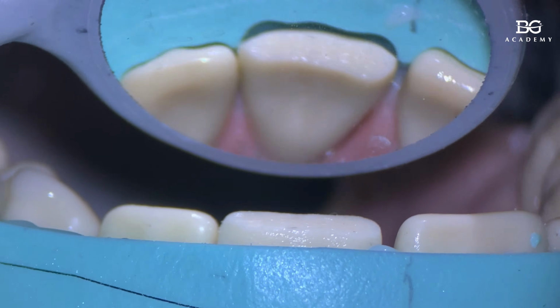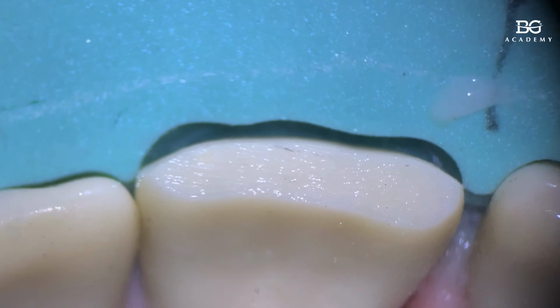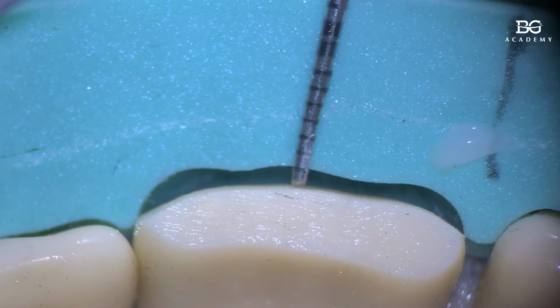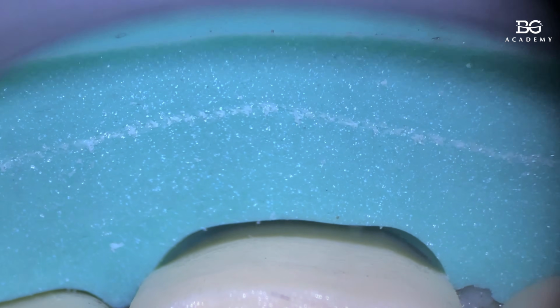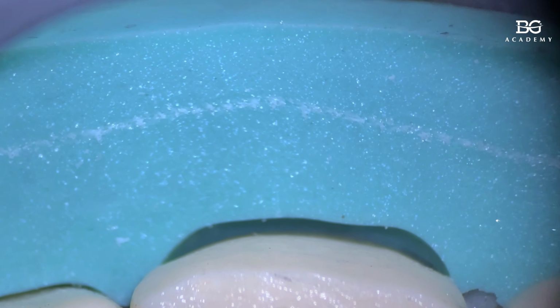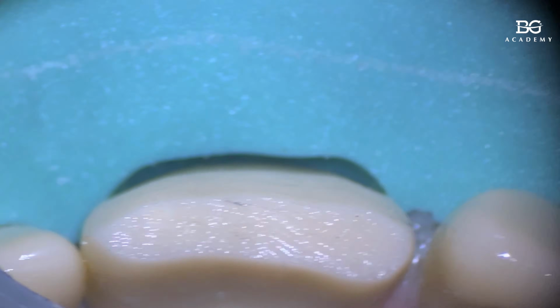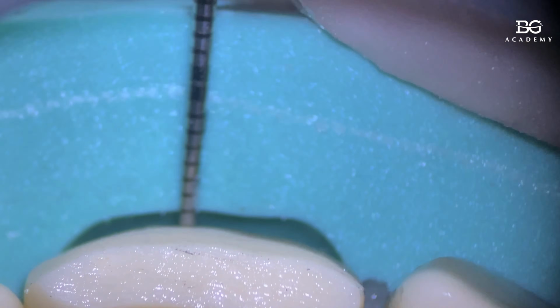So I will check with my mirror, with my periodontal probe. Here we have 0.5 millimeter. In the incisal plane, everything is fine, 0.5. But I use a 0.4 depth cutter, and I have my 0.5. This is what I was speaking about. If I would be using 0.5, for example, we get 0.6. That's why it's ideal to work with one size less.